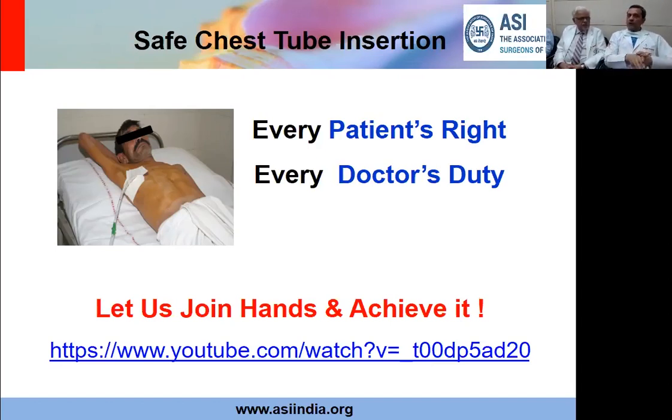Now, at this stage, I've seen people reaspirating, and we've had patients having had 7, 8, 9, 10 times aspiration. Remember, every aspiration in a radiology suite or wherever has a possibility of introducing infection. The more the number of aspirations, the more the chance of infection.